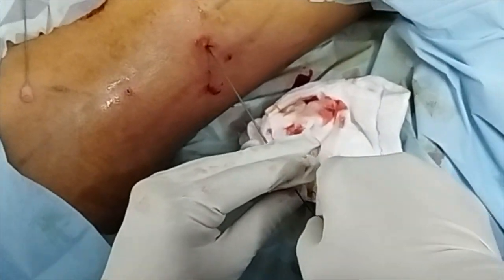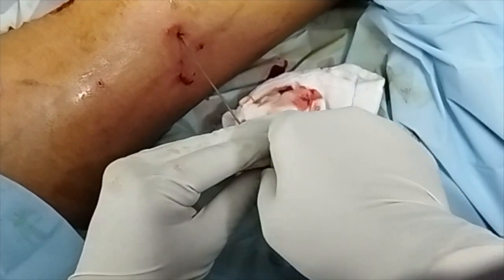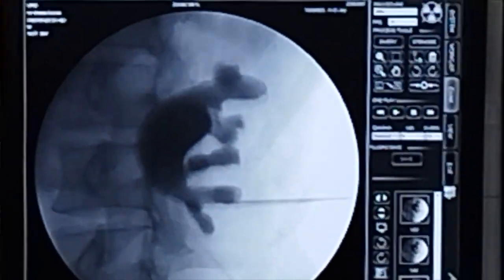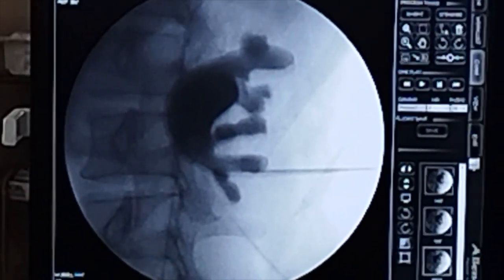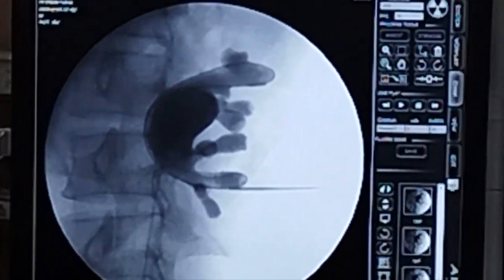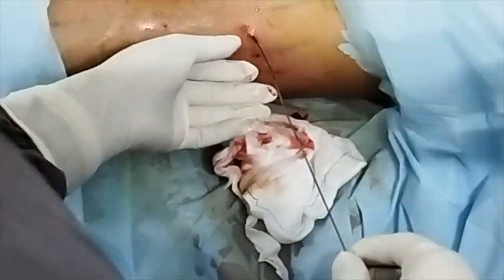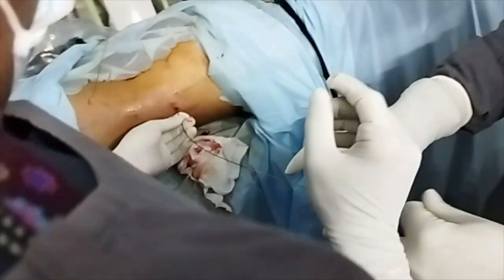Now I came close to the tip of the 12th rib. That puncture clearly allowed the guide wire to go into the pelvis. You can see the guide wire coiling into the upper calyx. This was a pelvic stone, and the rest of the stone lithotripsy was uneventful.